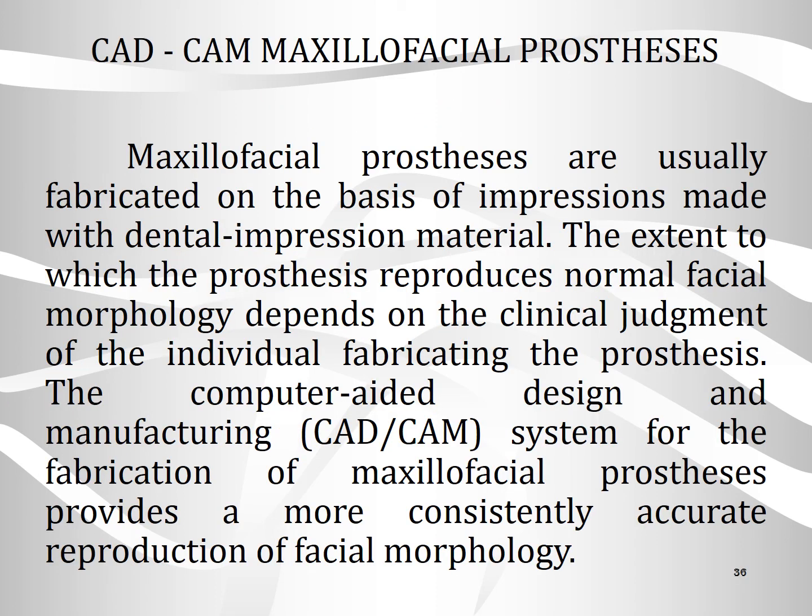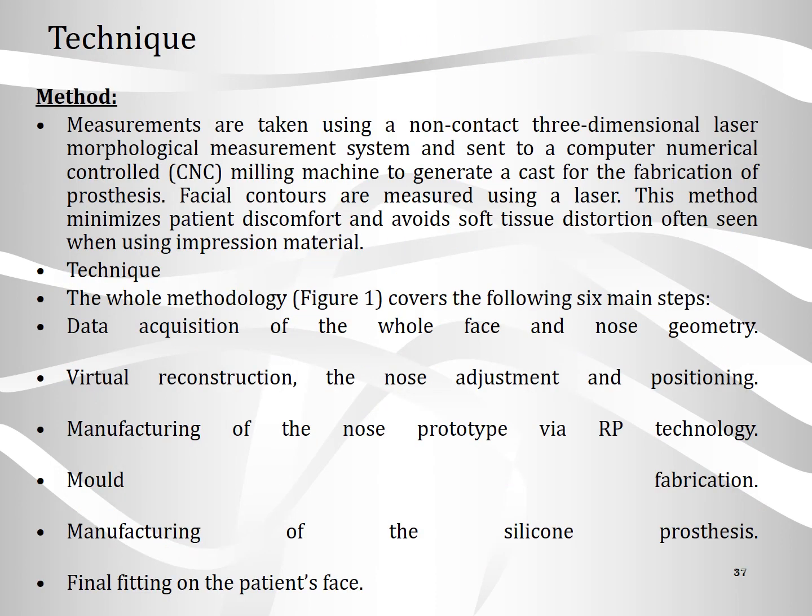Then coming to the CAD-CAM maxillofacial prosthesis. These prostheses are usually fabricated on the basis of impressions made with dental impression materials. The extent to which the prosthesis reproduces normal facial morphologies depends on the clinical judgment of the individual fabricating the prosthesis, and the computer aided CAD-CAM system for the fabrication of these prostheses provides a more consistently accurate reproduction of facial morphologies.